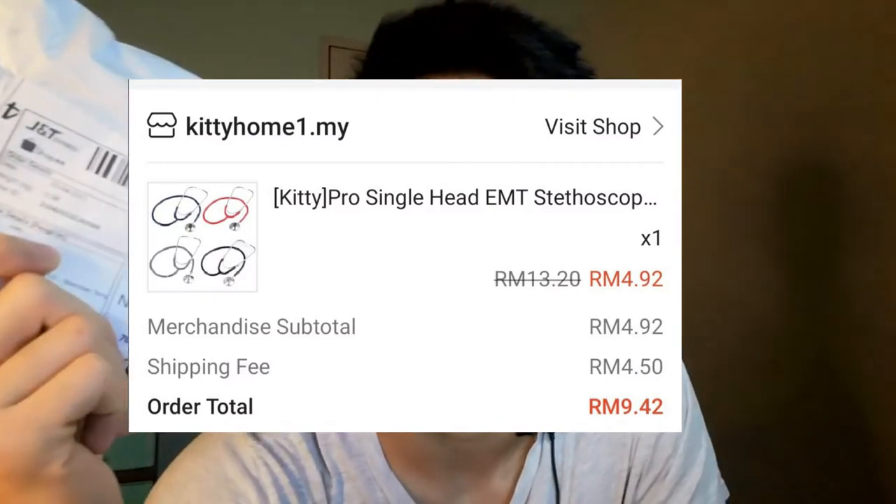Hey guys, welcome to the video. In today's video I'm going to review a stethoscope which is under 10 ringgit from Shopee, which I bought a week ago. It is from China, by the way.